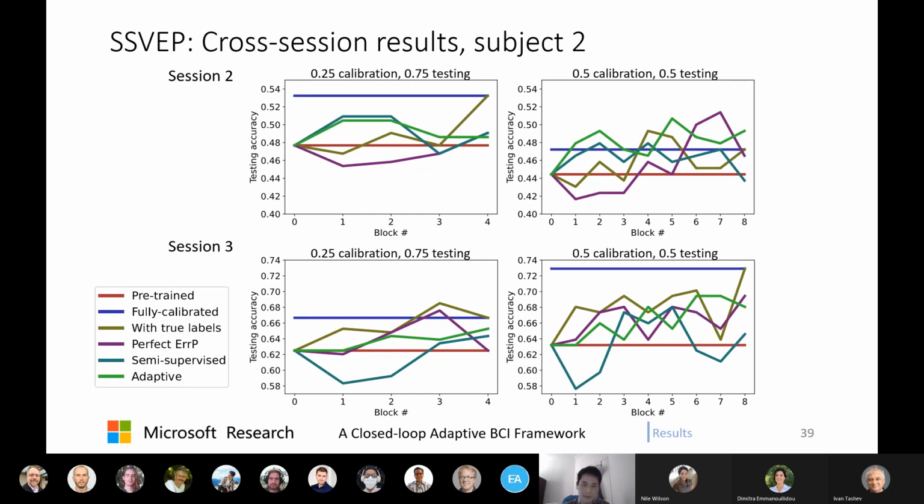He's a non-experienced person, and I think his signal quality, or the capability of him getting induced by the visual flickering, varies a lot more than mine.